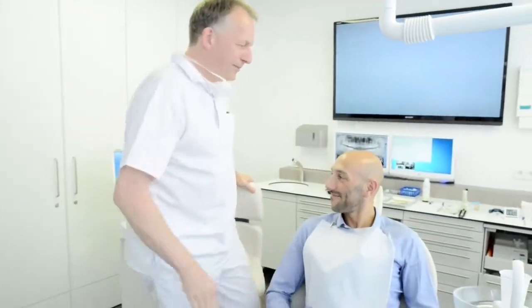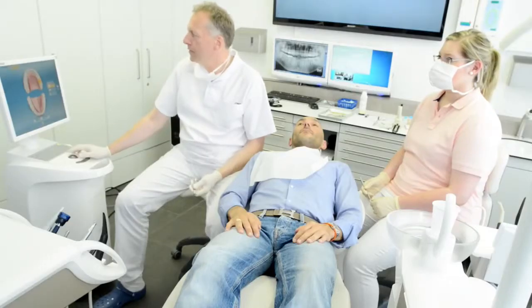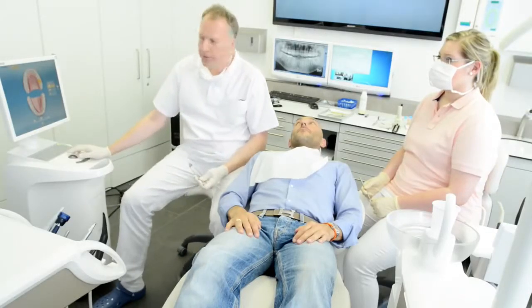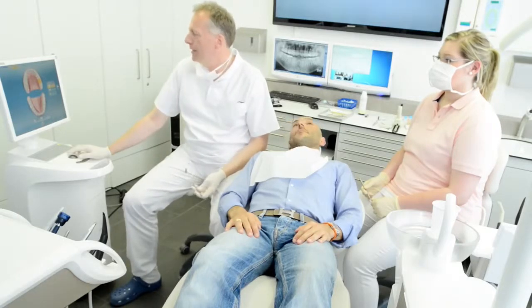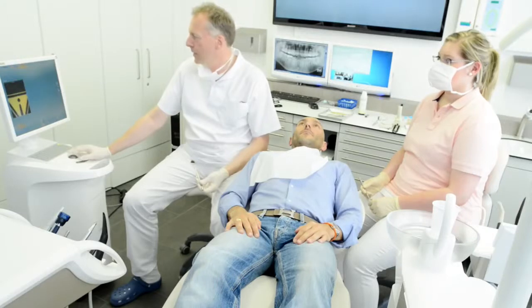Welcome to the Sirona CEREC BlueCam and Omnicam comparative video. This serves to clearly demonstrate the distinctions between the two camera solutions, highlighting their individual strengths and differences. As a simple example, we will compare the two systems in use on a routine onlay case on a molar.